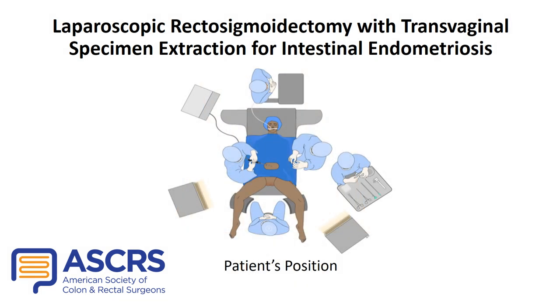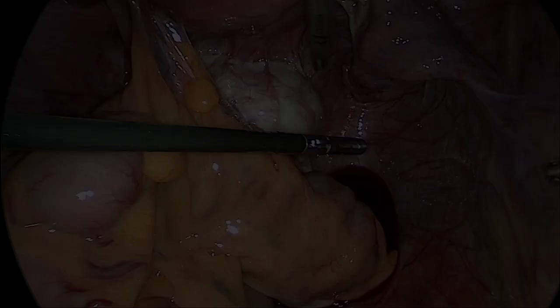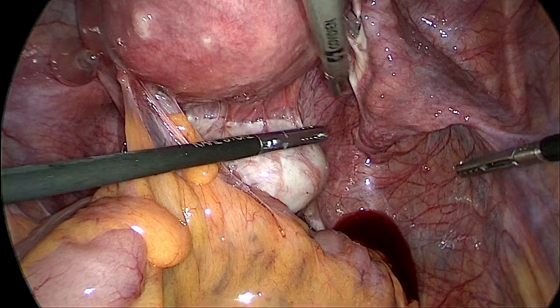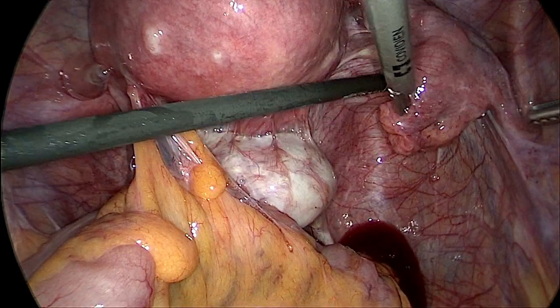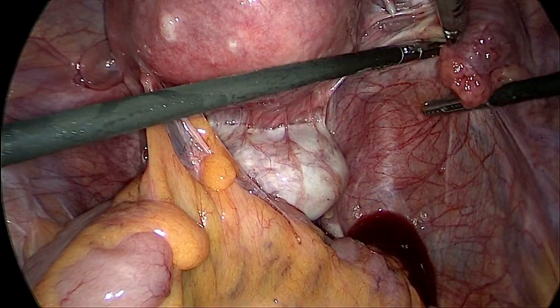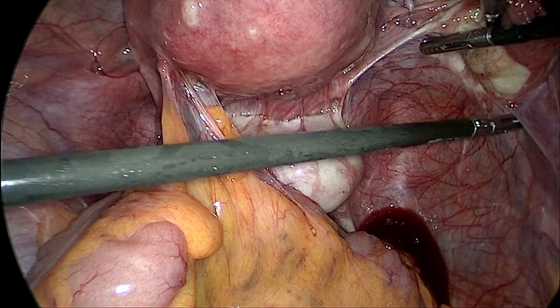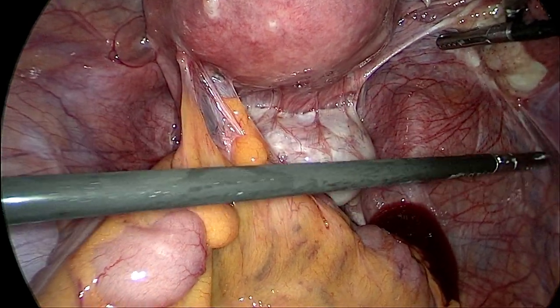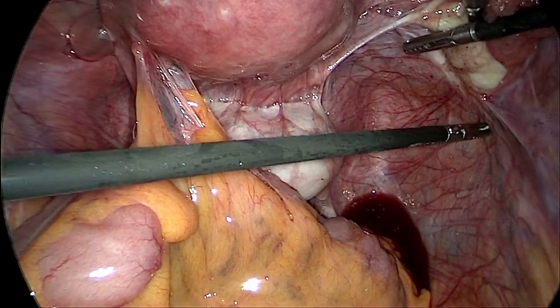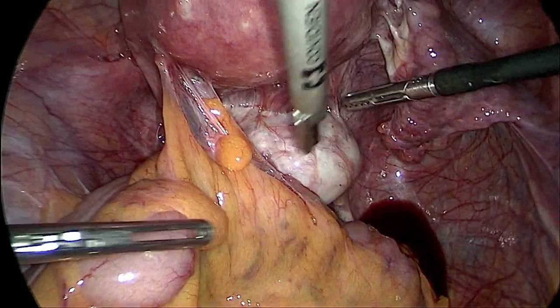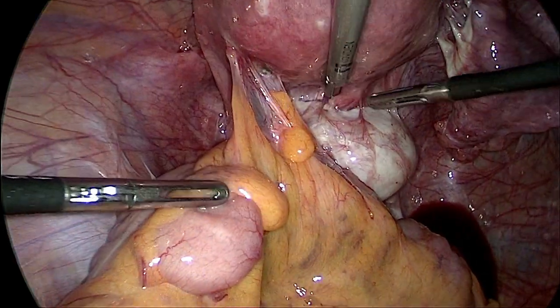The patient was placed in a slight Trendelenburg in the dorsal decubitus position. The surgeon then analyzed and identified fibrotic adhesions in the abdominal cavity secondary to the endometriosis.